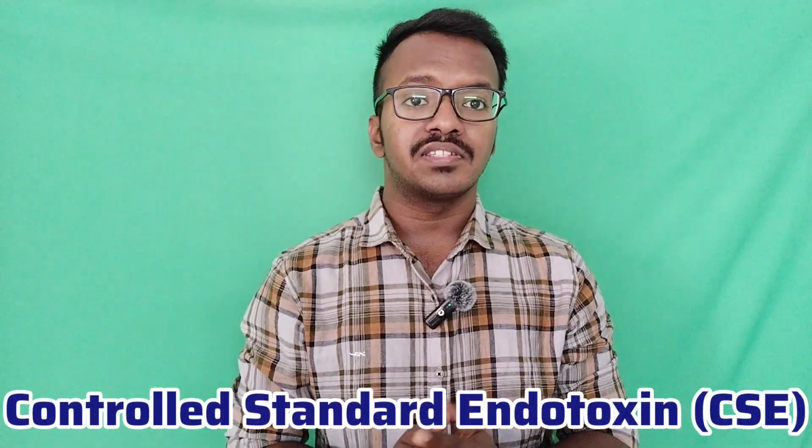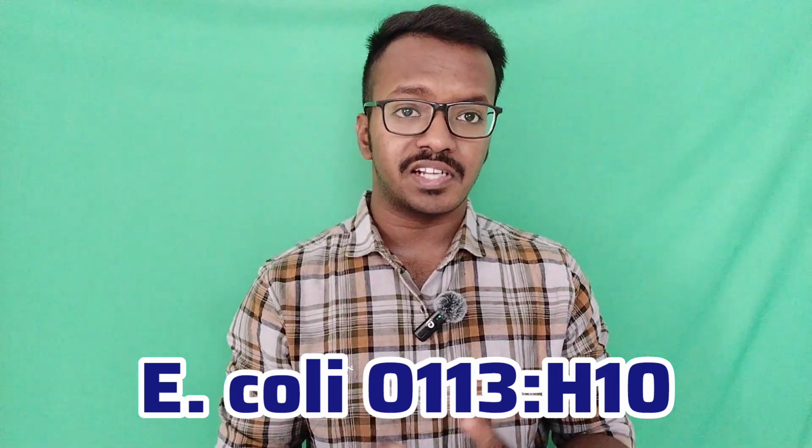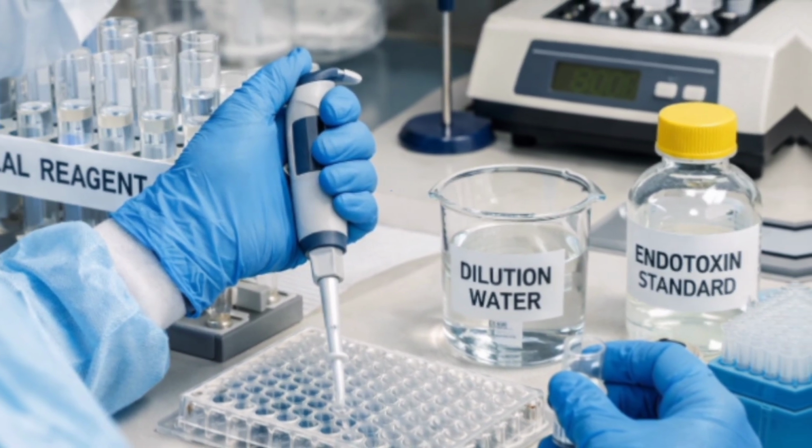Another important factor is controlled standard endotoxin, CSE. Controlled standard endotoxin is a purified endotoxin of known concentration which is derived from bacteria, for example, Escherichia coli O113:H10. It is a strain number. Whenever a new lot of CSE or lysate is received from the vendor, we need to perform the suitable sensitivity test. After the completion of the verification study, only then can we use that particular lot for routine analysis.